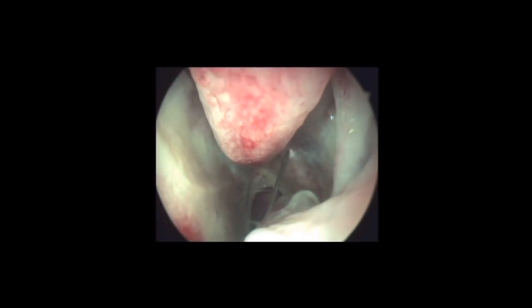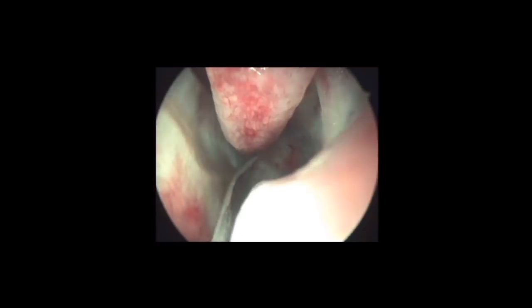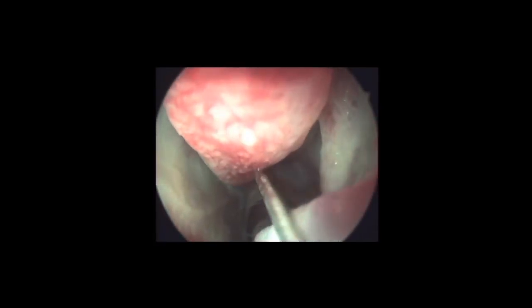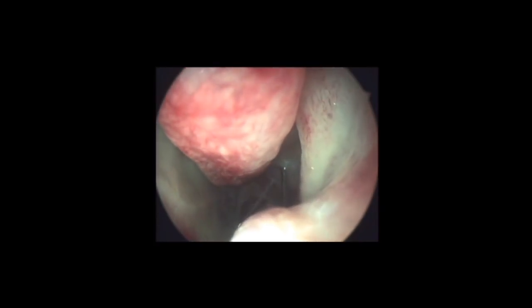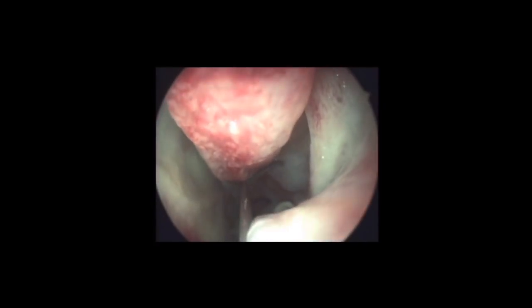For fungal maxillary sinusitis, the local anesthesia is prepared by taking 10 ml of 2% xylocaine with 10 ml of distilled water, mixed with 10 drops of adrenaline, which is injected at the posterior attachment of the middle turbinate, thus blocking the sphenopalatine ganglion. You could see the blanching of the mucosa.